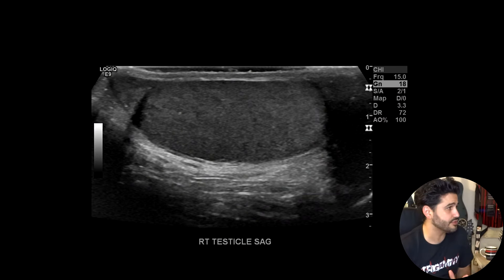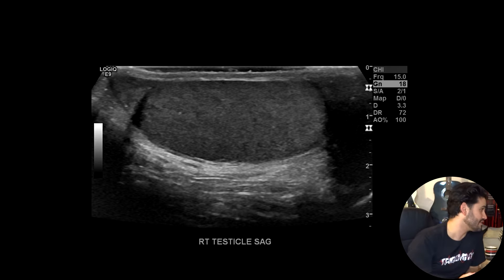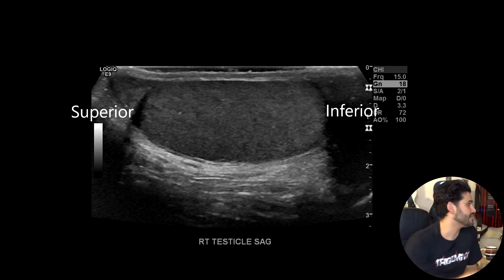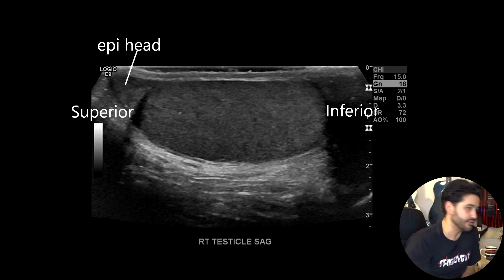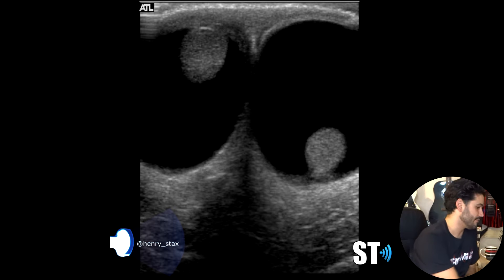Once you're done with the transverse twins views, you want to go sagittal. We start on the right first — sagittal right midline. Here you see the sagittal testicle: the superior pole, the midsection, and the inferior pole. The testicular echotexture is homogeneous. There's no microlithiasis, no tumors at least in this view, and no hydrocele or fluid around the testicles.